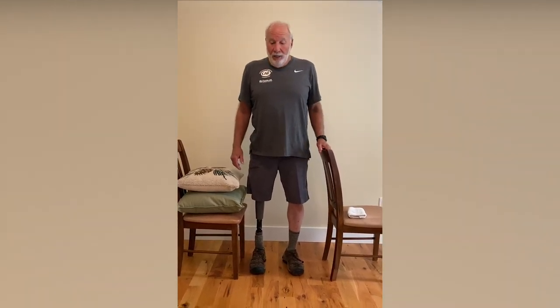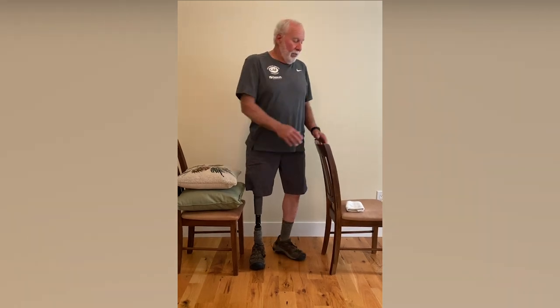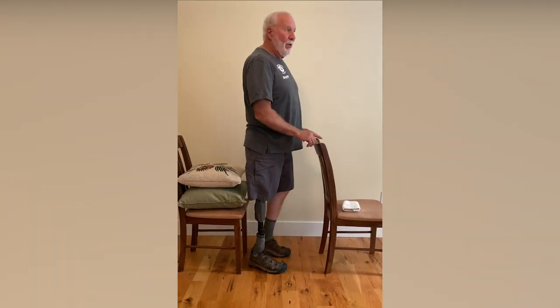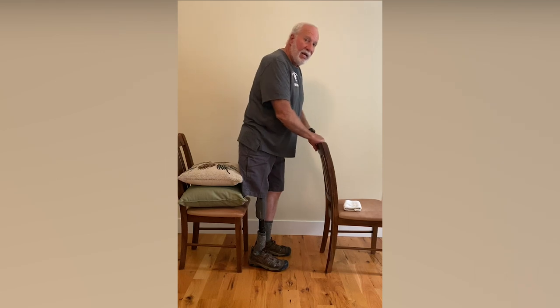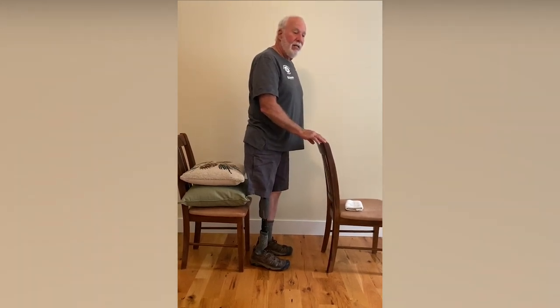Now we're going to use our squatting exercise motion to help us sit down safely into a chair and spread the load between our sound side and our prosthetic side. So what we're going to do when we start out, you can put some pillows on there so that you don't have to sit down quite so far. And then you're going to use a second chair just to help you balance. And we don't want you to use that to use your arms to push yourself up. It's just kind of to help you maintain balance.